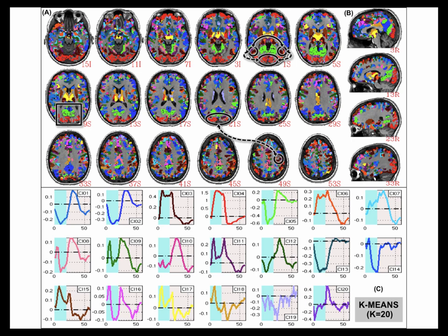But typically, when we do event-related, if you give a half-second stimulation, you get a pretty nice big response that looks like a gamma variate. It's just bigger than you would expect for the most part. And that's usually a good thing. Most people don't really mind, unless they really care about looking at the amplitude of BOLD as a function of duration to get at what neuroactivity is actually going on. And then you have a problem.